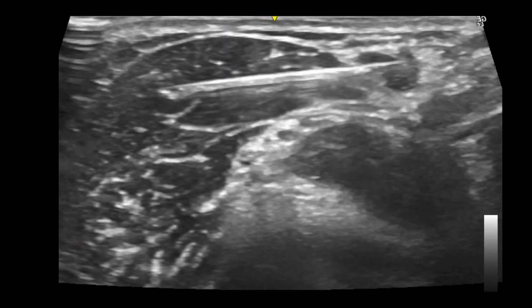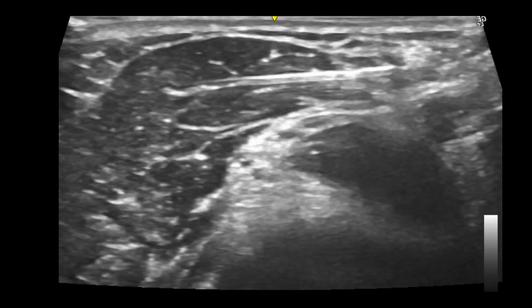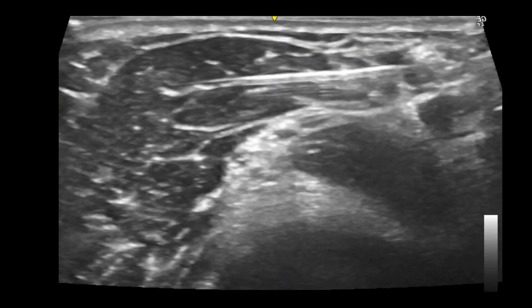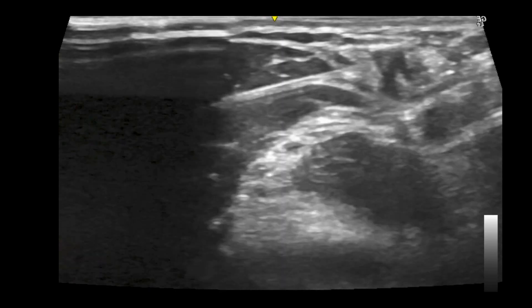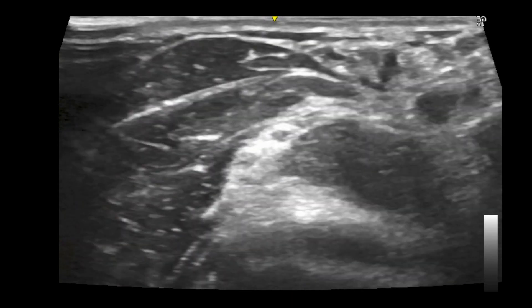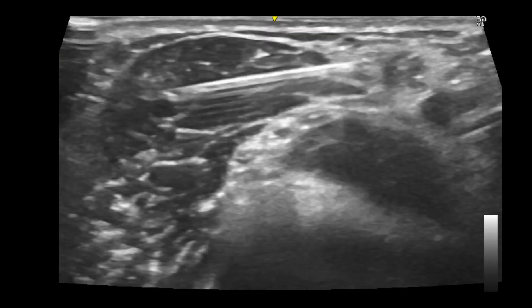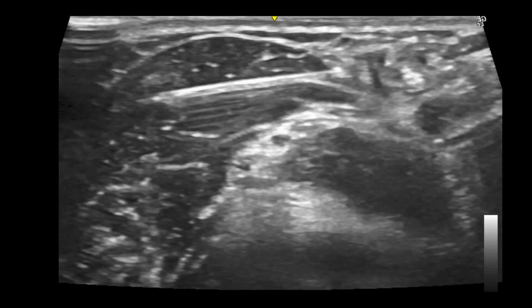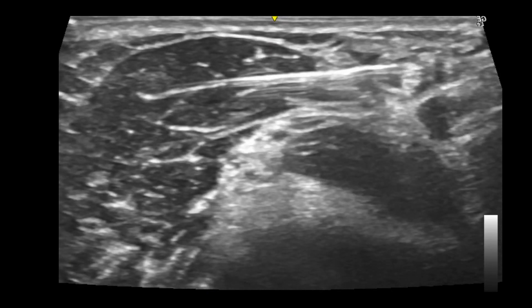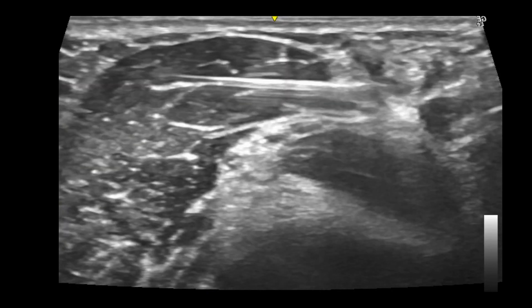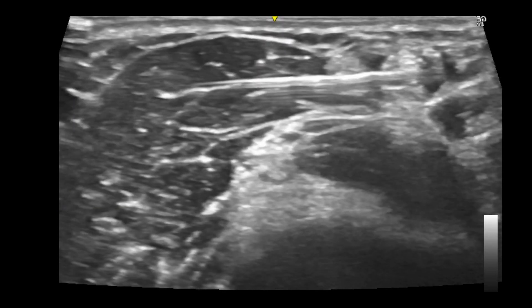As you inject local anesthetic, you'll see the nerve becoming highlighted a lot clearer. Small volumes of local anesthetic are being injected, and with each small aliquot you can see the highlighting of the lateral antebrachial cutaneous nerve. The total volume injected in this video — it looks like a lot — was actually about two to three cc's maximum.